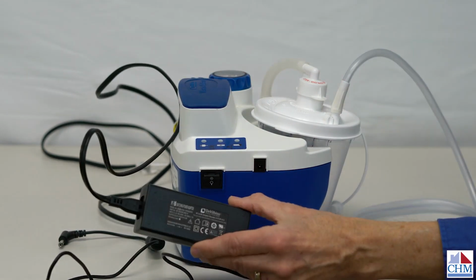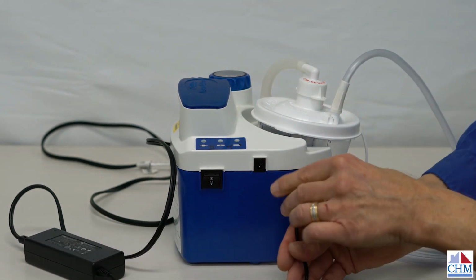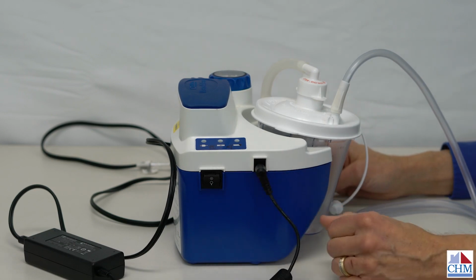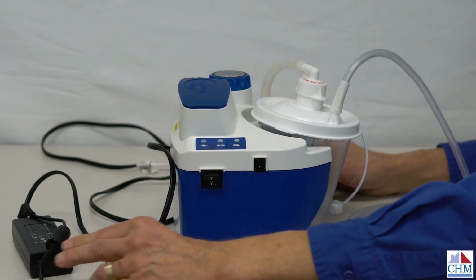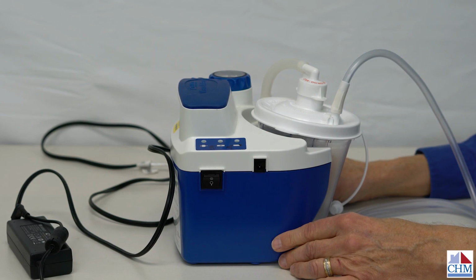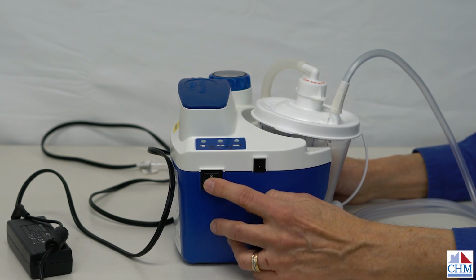So you notice it's an inverter here, so we plug into an AC source, and then the connector is plugged in here. It is a 12 volt system, meaning there is a car adapter for it also. So if you needed to operate it in your vehicle, you could just plug it into a DC automotive adapter. The on-off switch is right here in the front, turning it on and off.